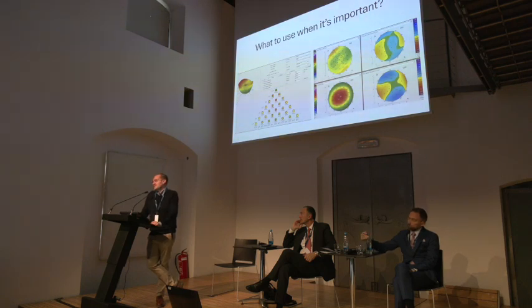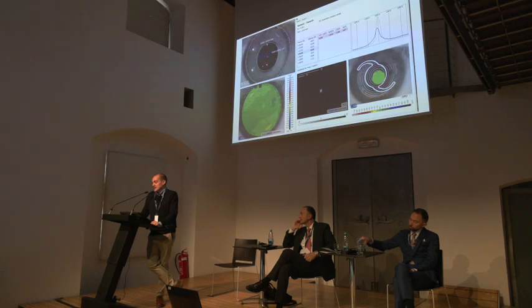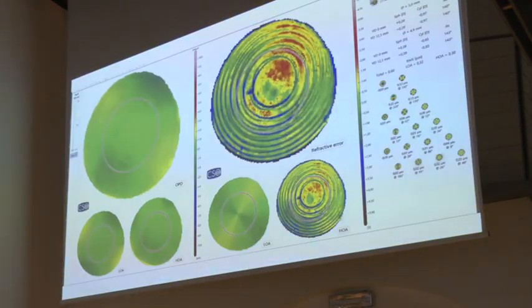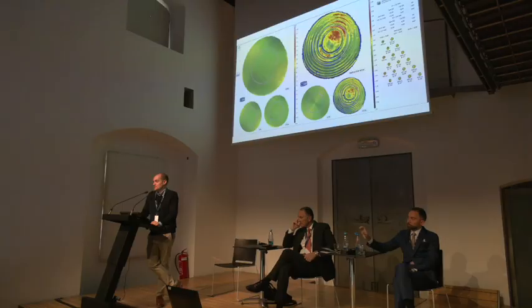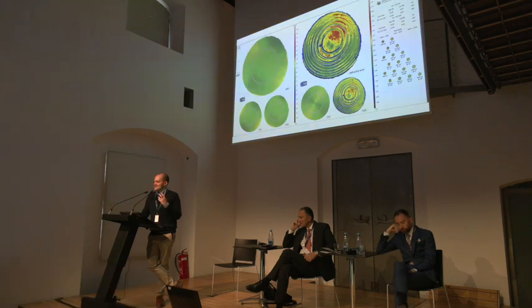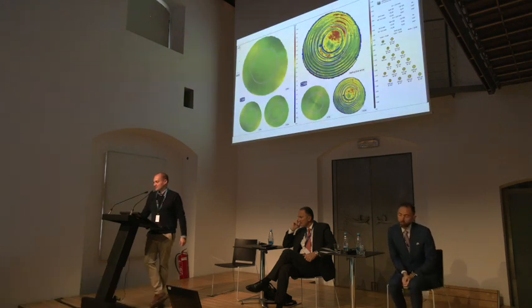And I looked at the CSO data. And we calculated the lens using the ray tracing function on the Phoenix software. And I think this is a premium IOL. So you know what we chose and what we trusted. When it comes to trusting your devices, you need to know the basics, how they work, why they work like that, and get the most out of them. Okay, thank you.